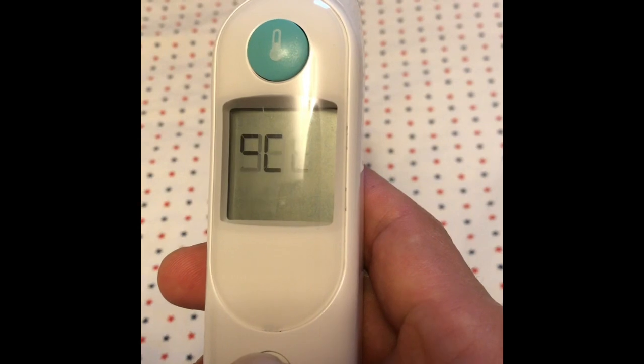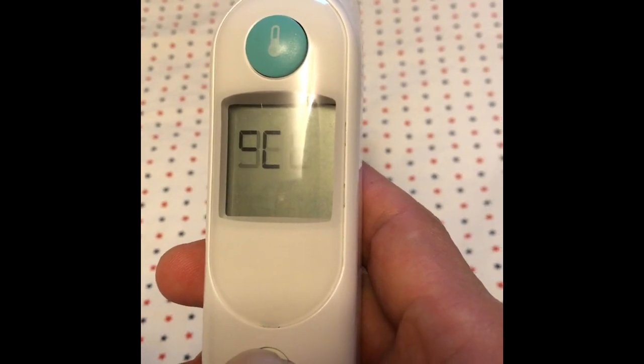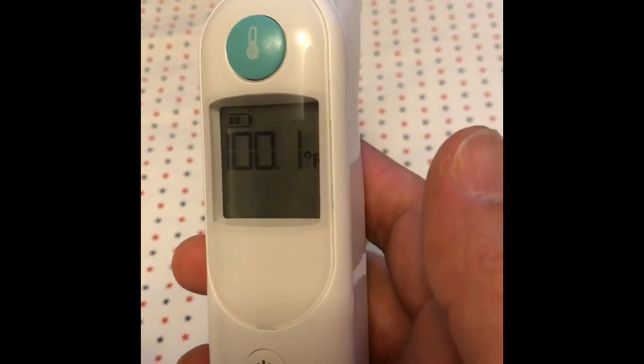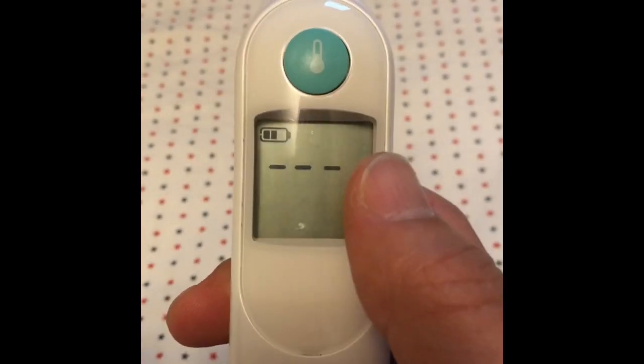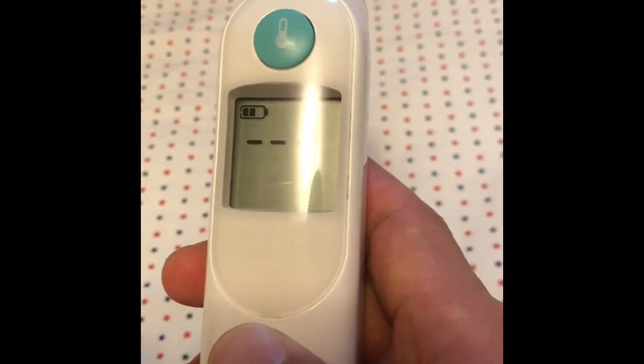it will show Fahrenheit and Celsius degree. When you release it, you choose the selected unit. I'll choose Fahrenheit now. Now I turn it off.